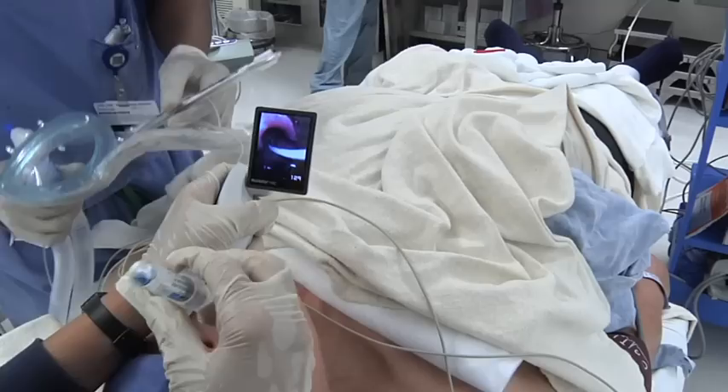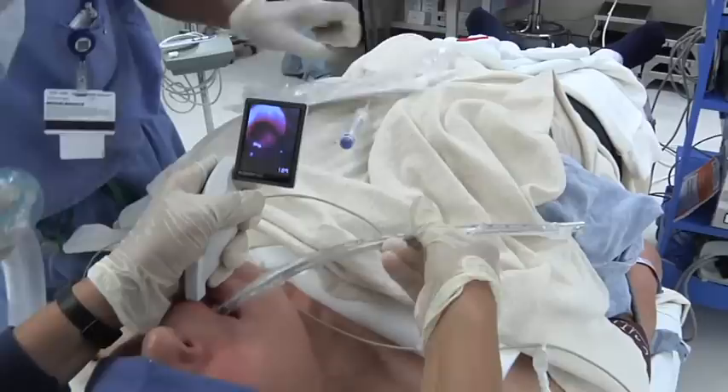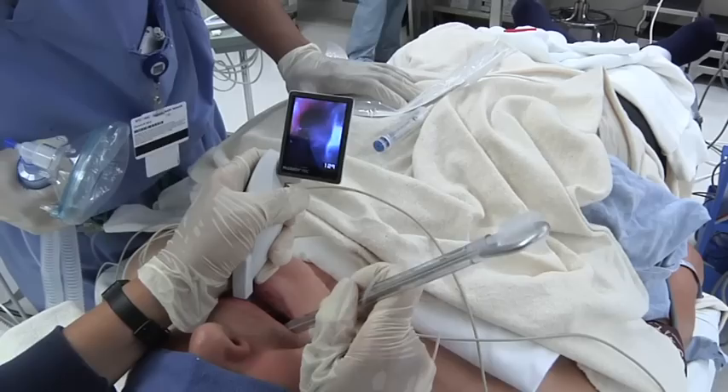Vocal cords — look at that, still moving a little bit. The vecuronium we have is very cheap, we'll give it a moment to work. Okay, now the two-finger technique — right in. Very nice. Let's see if the cords are open. The cords are closed — hang on a second — there we are.